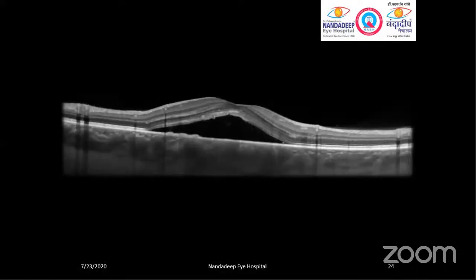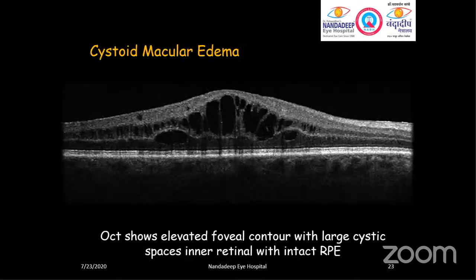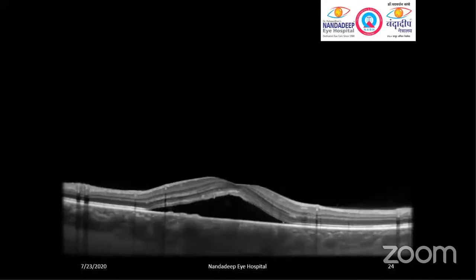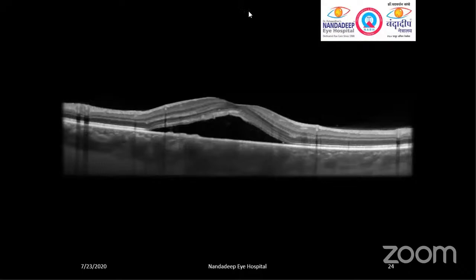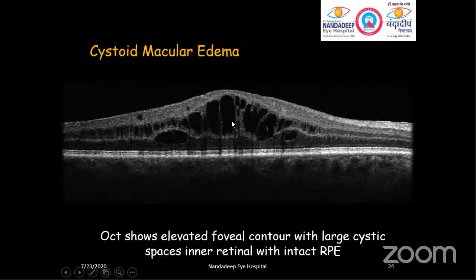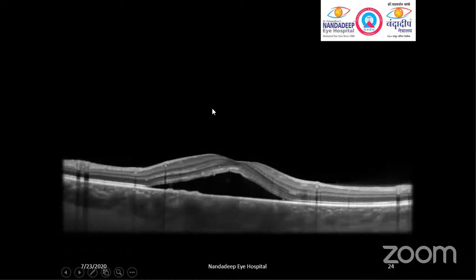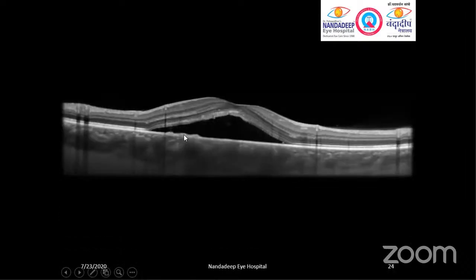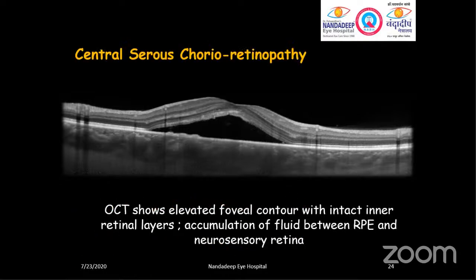Now what does this picture look like? It looks similar to the previous one but there is a big twist. Here we see foveal elevation, which is common, but the inner retina is totally intact — there is fluid accumulation between the RPE (outer retina) and the neurosensory retina. In the previous slide, the RPE was intact, the neurosensory retina was intact, but cystic spaces occurred in the inner retinal layers. Here the inner retina is totally intact whereas there is fluid accumulation between the RPE and the neurosensory retina. This is a very typical case of central serous chorioretinopathy (CSR or CSCR): OCT shows elevated foveal contour with intact inner retinal layers and accumulation of fluid between RPE and neurosensory retina.